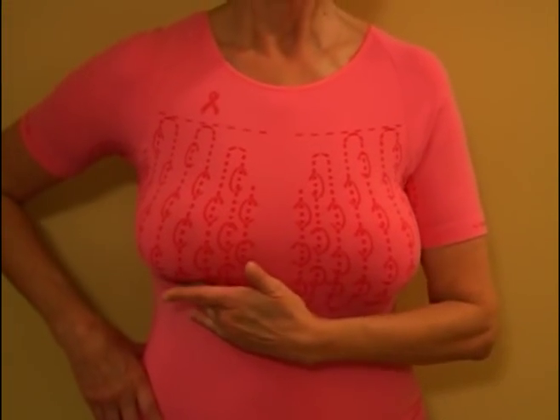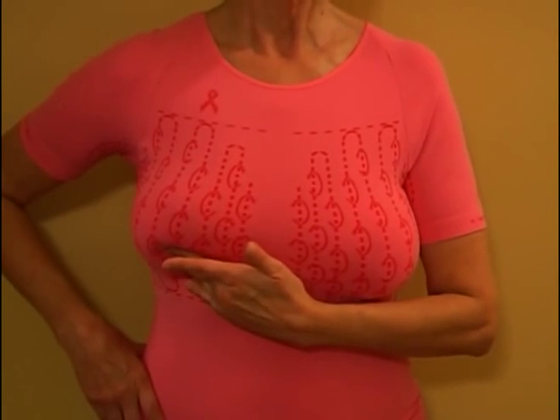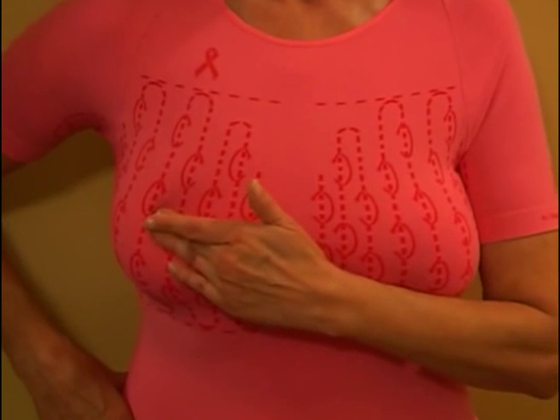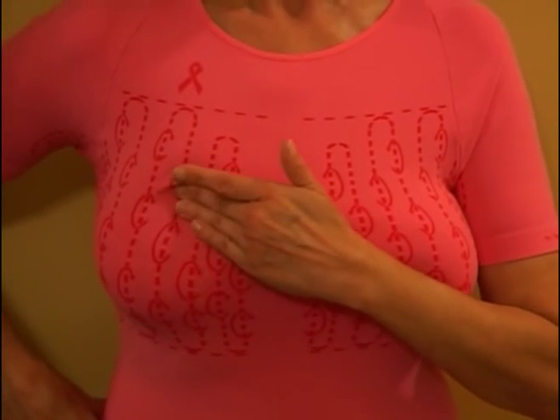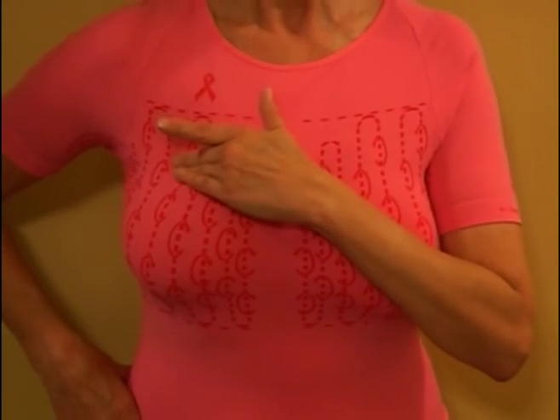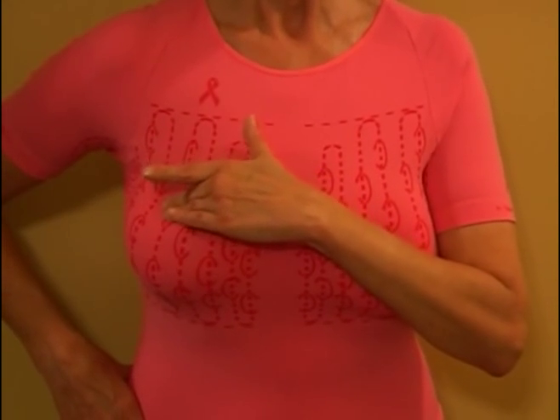Step 1. Begin by putting on your breast check top. While looking in the mirror with your shoulders straight and your arms on your hips, follow the printed pattern on the garment by moving your fingers up and down vertically, in rows, as if you are mowing a lawn. This will ensure that the entire breast is covered.